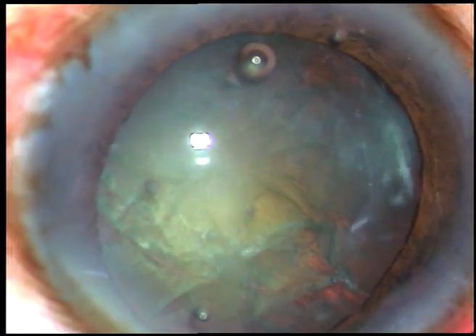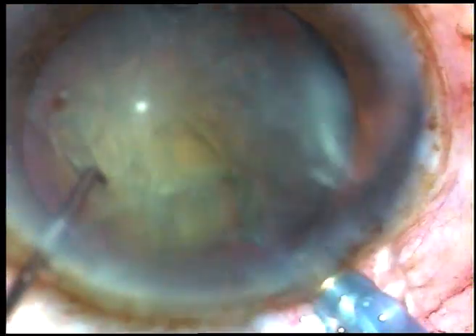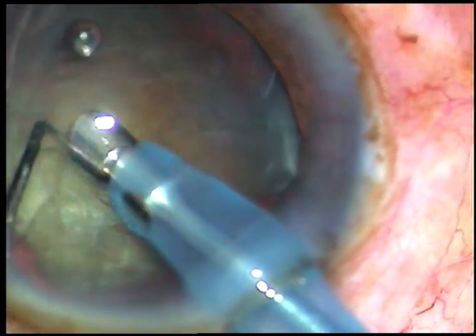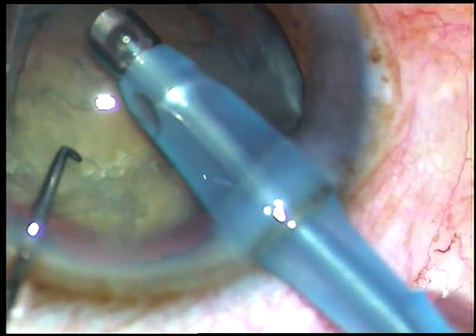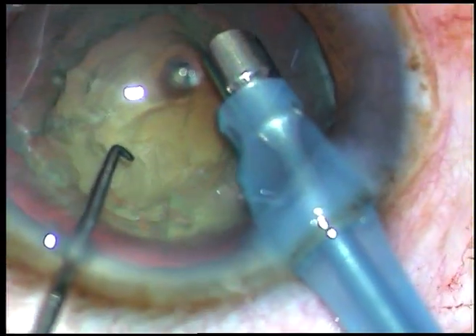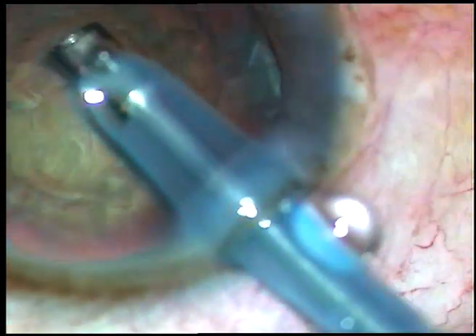However, I could complete the rhexis and hydrodissection without any problem and now I am going to manage the nucleus. The tip of the phaco handpiece has been introduced into the anterior chamber. After cleaning the superficial cortical matter, I plan to do direct chop.